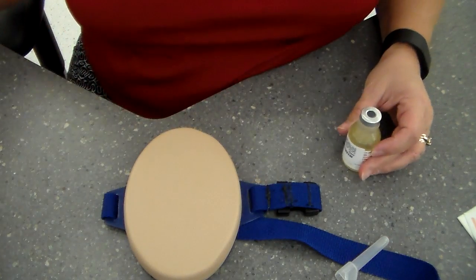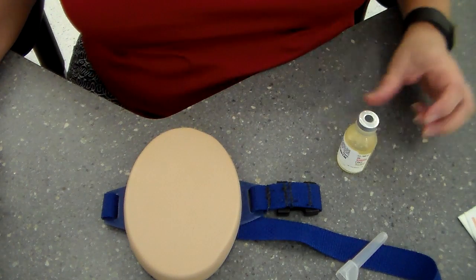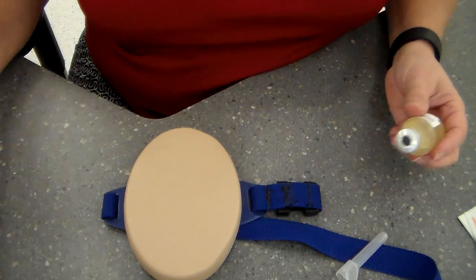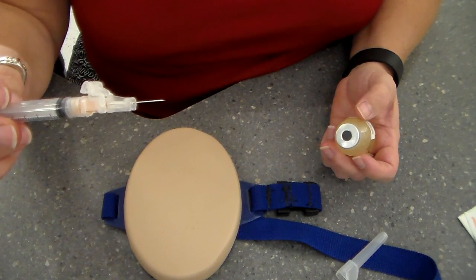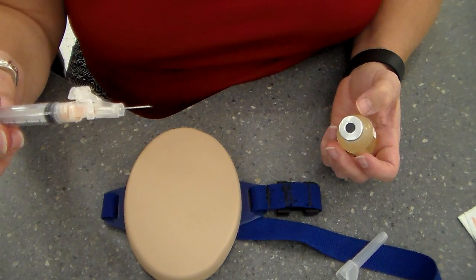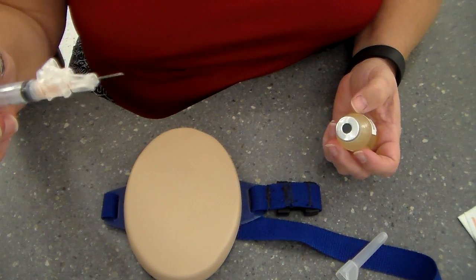All right. So for this demonstration, I have a 3 milliliter syringe with a 25 gauge by 5/8 inch needle on it. Is that a proper needle size for a subcutaneous? If you don't remember, look at the chart that I supplied for you on Blackboard. It is correct.